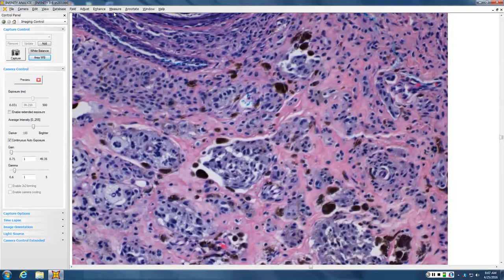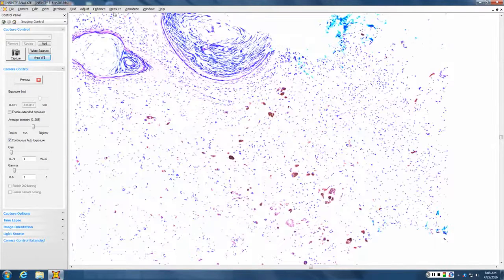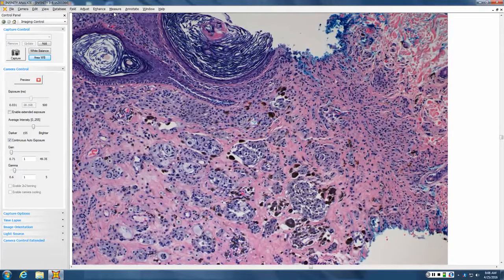So we got a combined nevus where the outer part just looks like a banal nevus, and then you have the central nodule, which is surrounded by heavy melanophages. The nuclei are small, hyperchromatic, smudged nuclei, but they really are quite small. That's a deep penetrating nevus type of population.